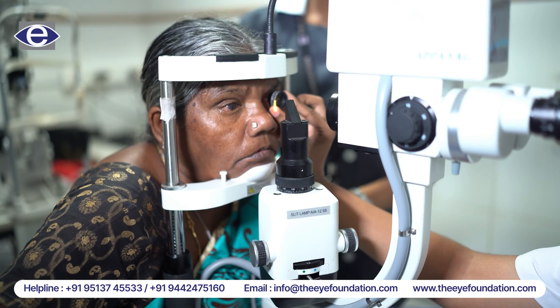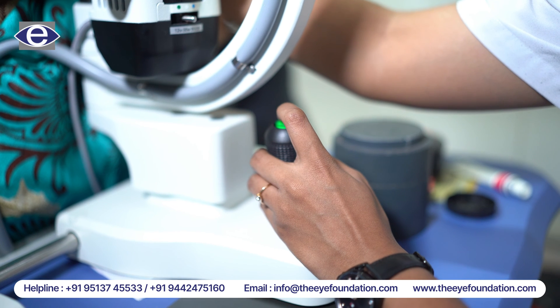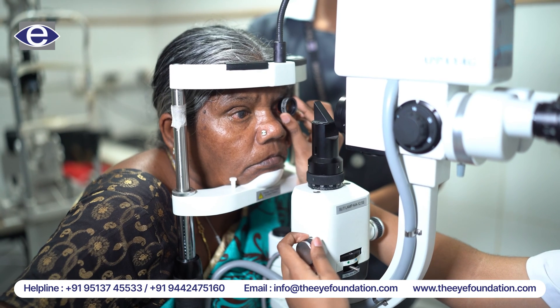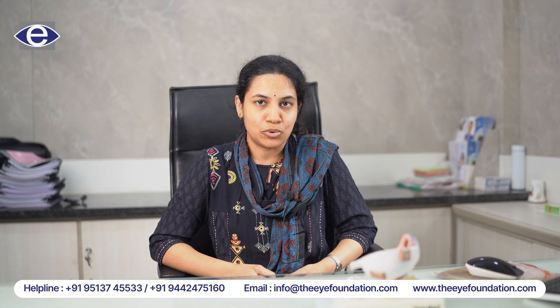The patient's head is rested on the chin rest and then the doctor, by using a lens, delivers laser shots to the peripheral part of the iris to create a small opening for the aqueous humor to flow through.